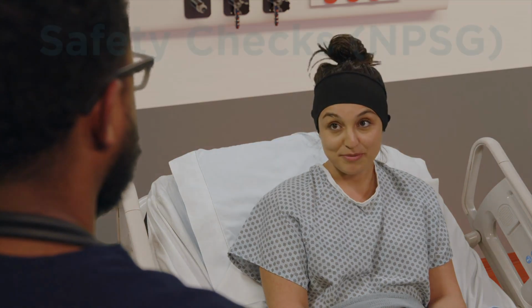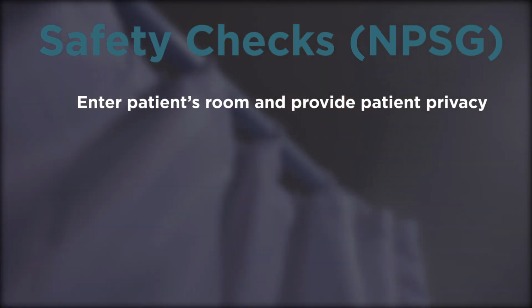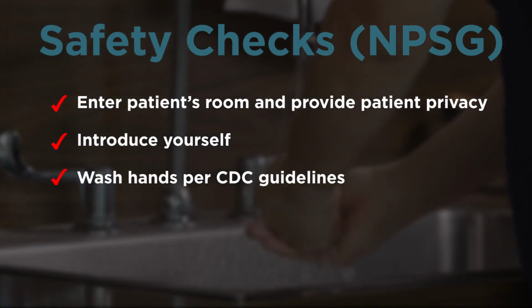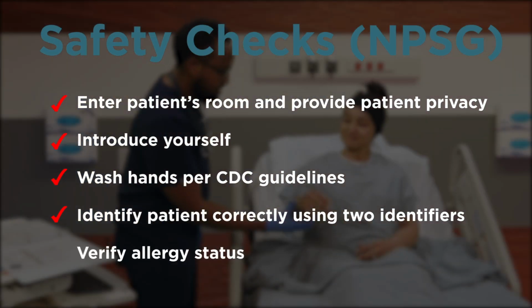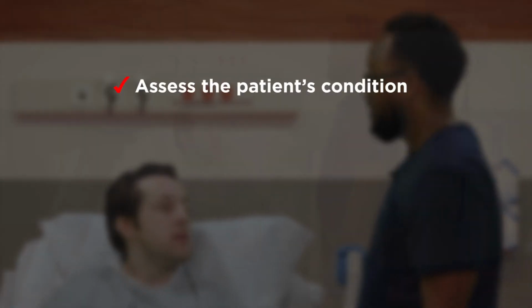Safety checks, NPSG. Enter the patient's room and provide patient privacy. Introduce yourself. Wash hands per CDC guidelines. Identify the patient correctly using 2 identifiers. Verify allergy status. Assess the patient's condition.